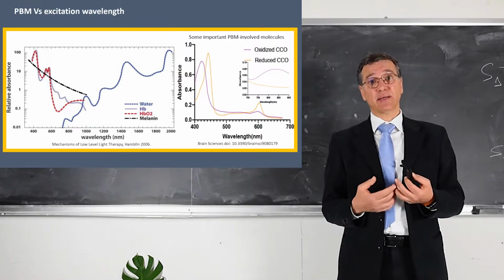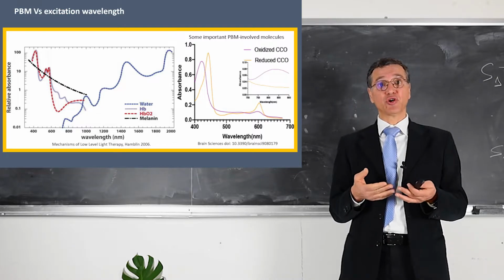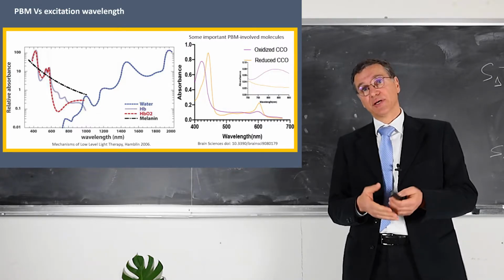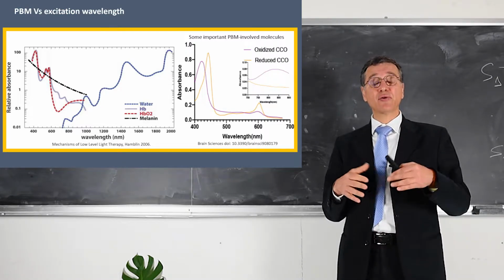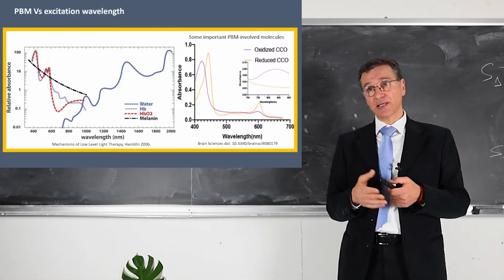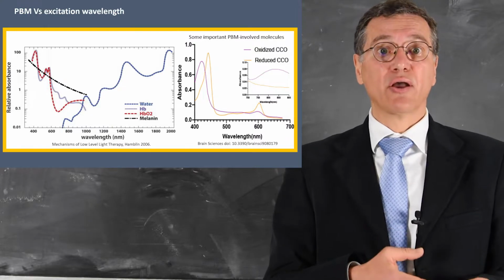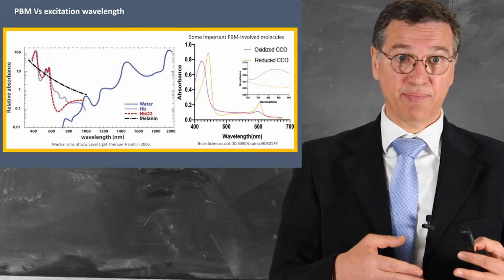And that depends pretty much on the density of the tissue, the scattering, and the absorption on the matrix, the chemical and molecular composition of the tissue. And if we have a look, as you can see in this slide, at the absorption spectrum of oxy and deoxyhemoglobin, melanin and water, we see, of course, that by changing the wavelength, we can go deeper or less deep.